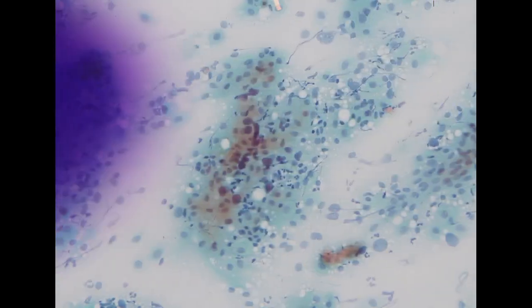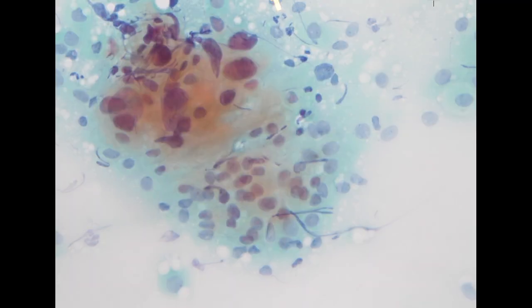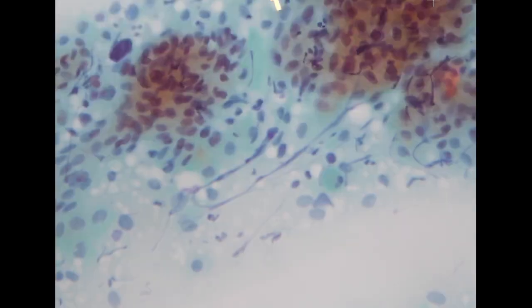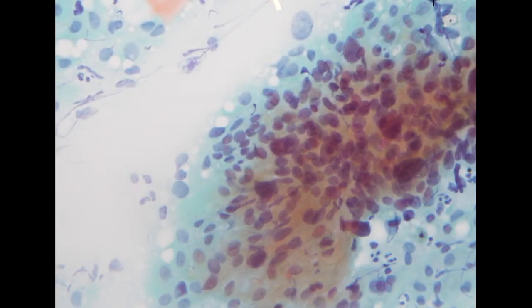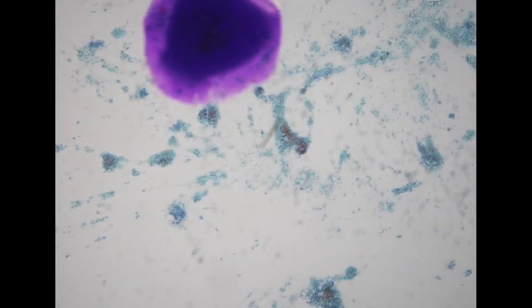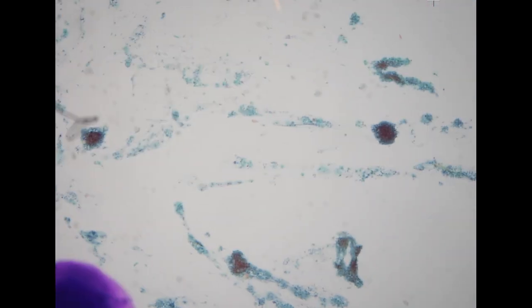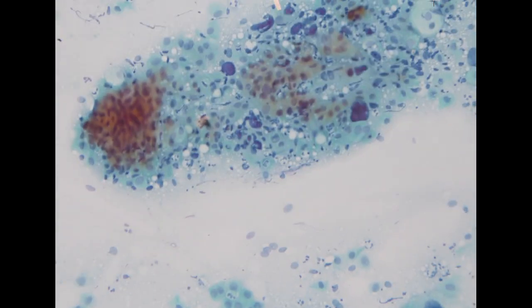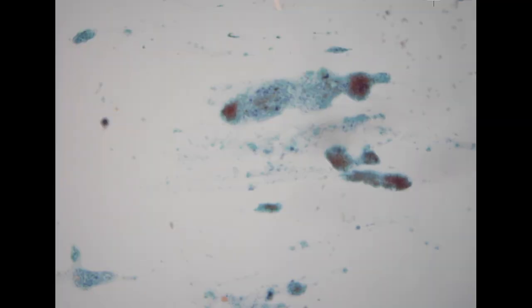Which means there is no cervix in this patient. So the smear is coming from the vagina. So there is a much lower risk to develop a precursor lesion by HPV in the vagina compared to the cervix. So overall, we do see some atypical cells, but these atypical cells have a low NC ratio. The chromatin pattern is smudged. It is very frequent that we can see naked nuclei, and the smearing pattern is throughout the entire smear.